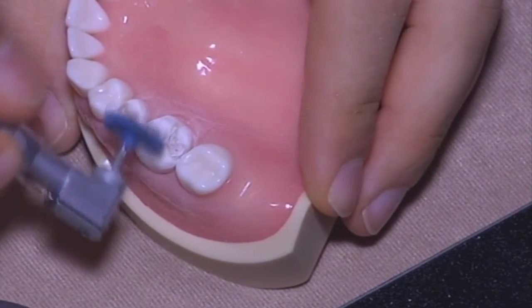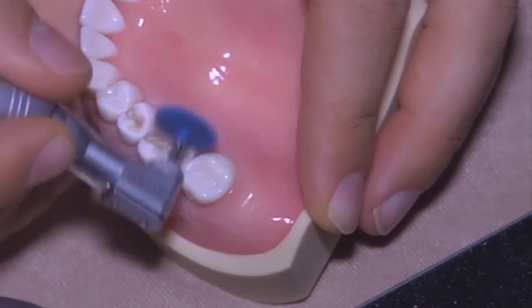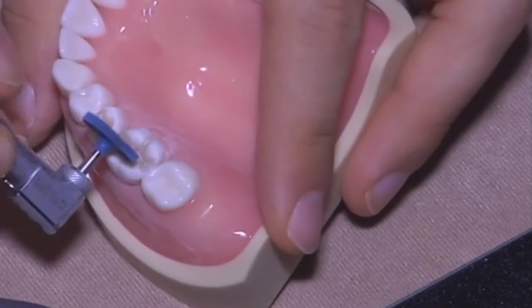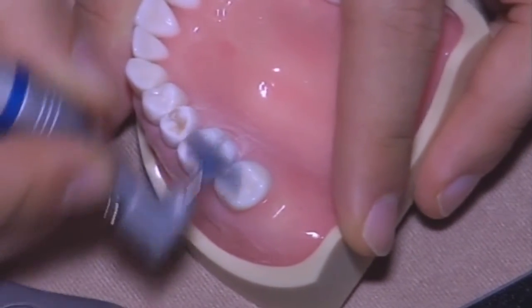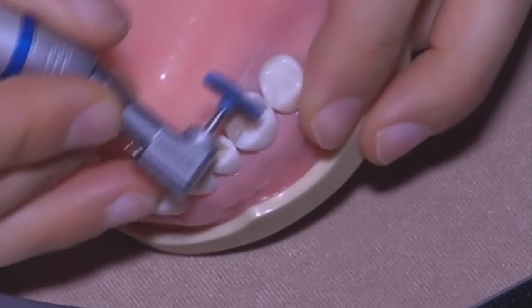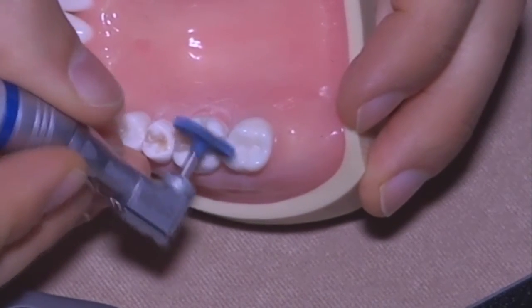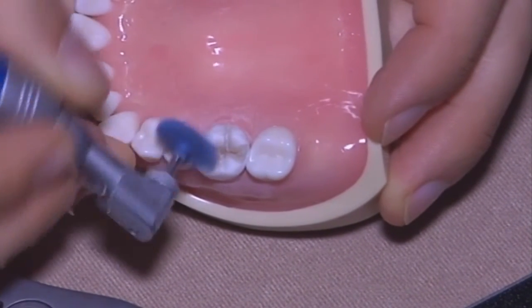You have two colors. The first one is more aggressive, is to remove the excess and start cleaning. So this one has a more polishing result.